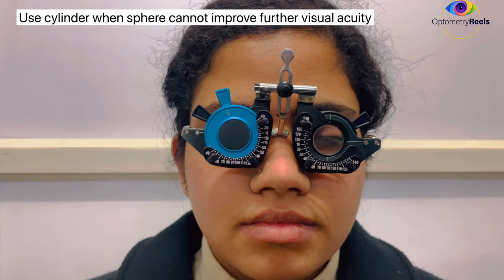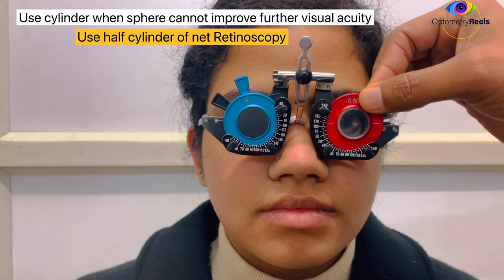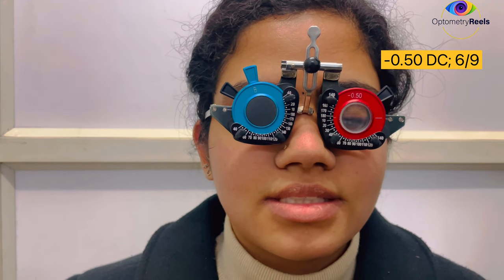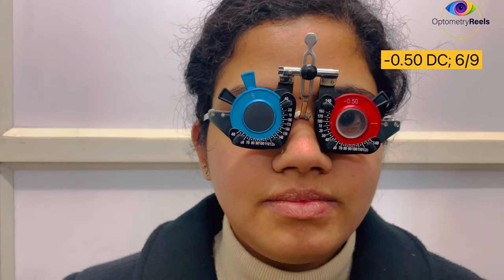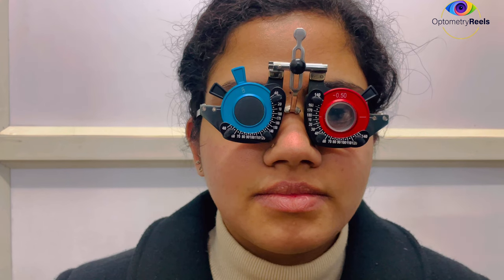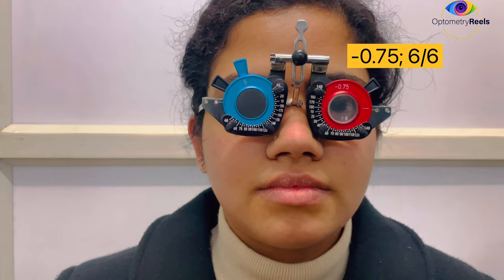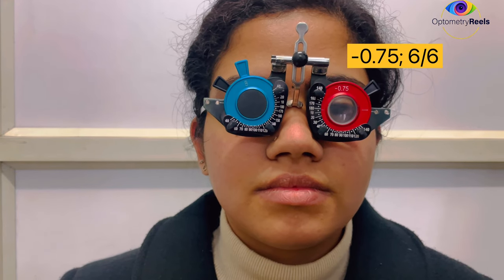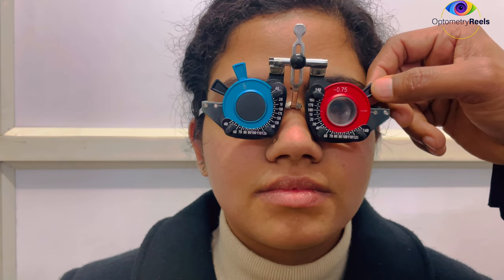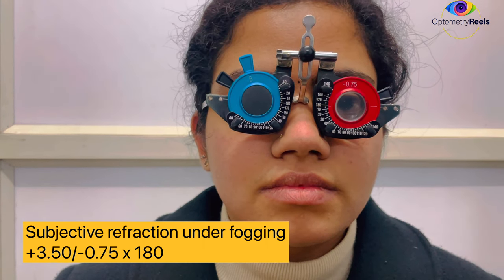Since retinoscopy showed minus 1 cylinder, we add half of this — minus 0.5 cylinder at axis 180. The patient can now read the second last line but not the last line. So we increase the cylinder to minus 0.75. Now the patient can read the last line. This is the end point of fogging. We obtained plus 3.5 with minus 0.75 cylinder at 180 axis.